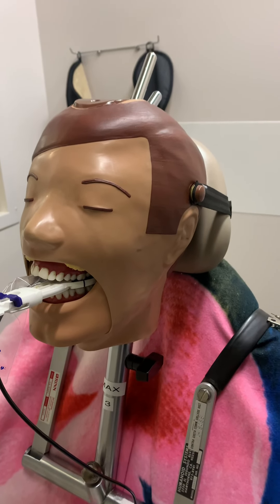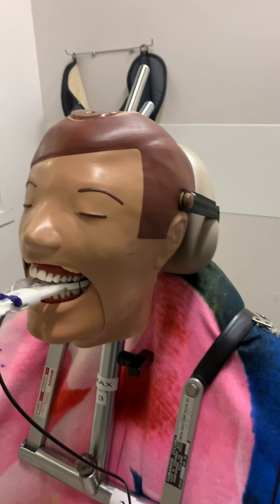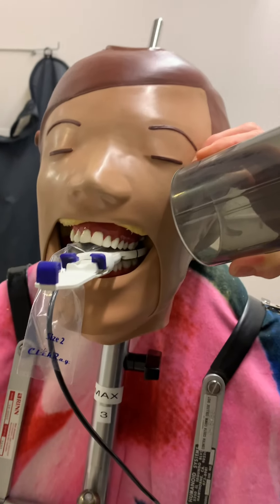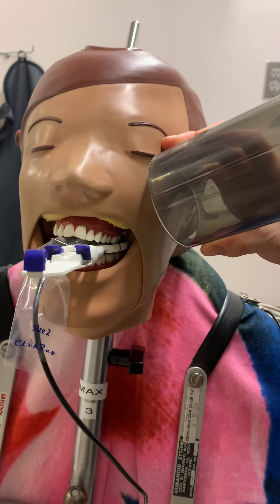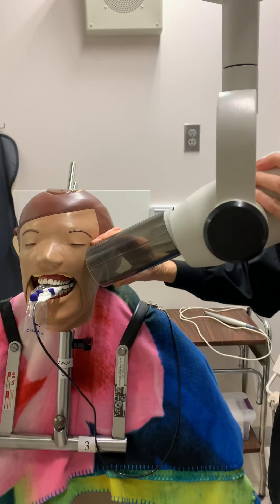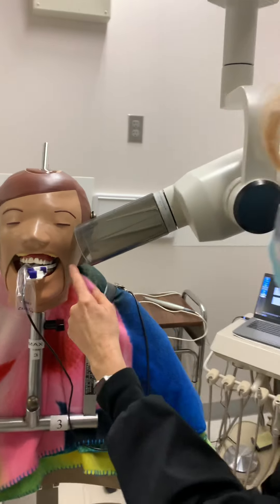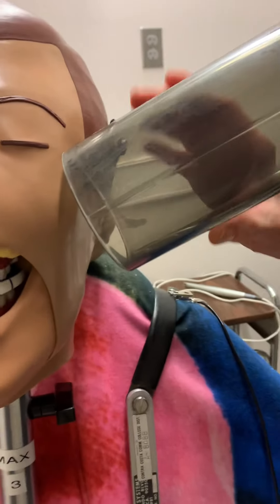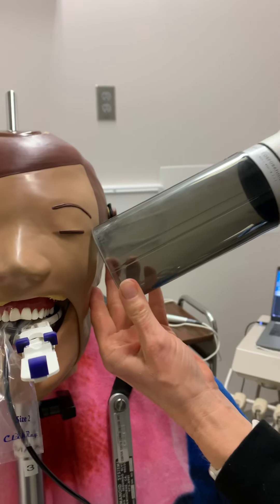And then I'm going to take my PID. My normal molar shot would be like this, but what I'm going to do since it's a distal oblique — I just take it and turn it to the distal. I'm going to check it. The central beam is going to be hitting right up here. My angulation looks good.